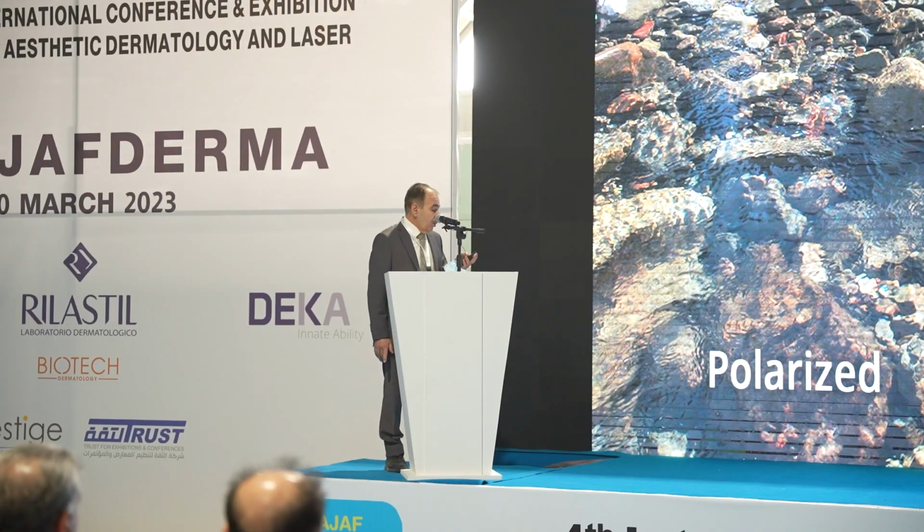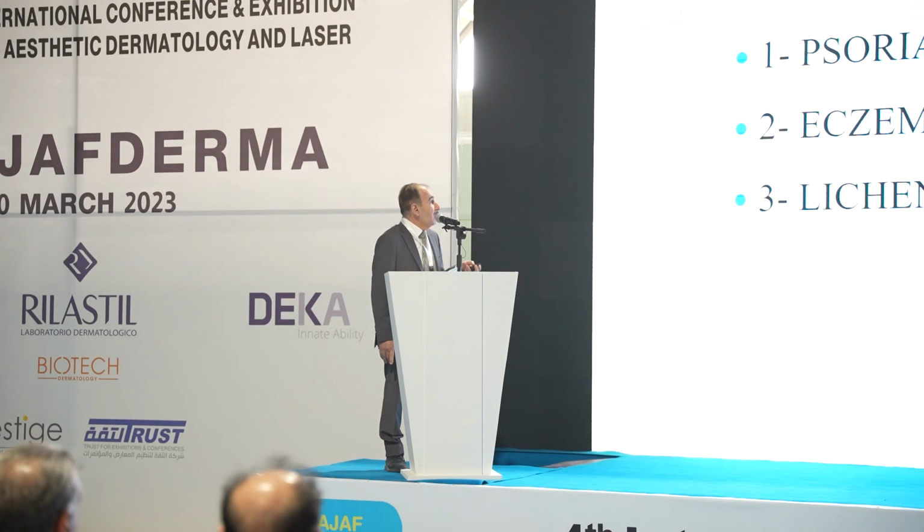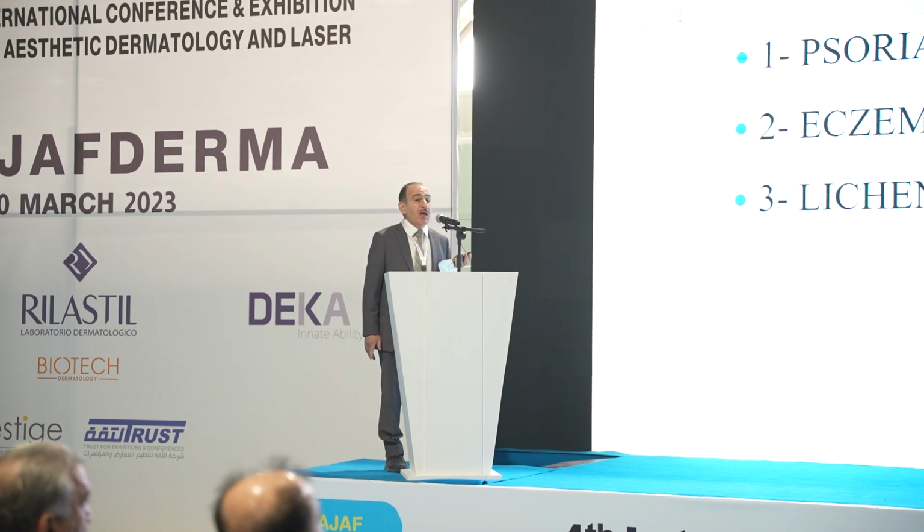Some of these things you can imagine, like blood vessels. Today, I'm going to discuss the dermoscopic features of three very common inflammatory skin diseases: psoriasis, eczema, and lichen planus.